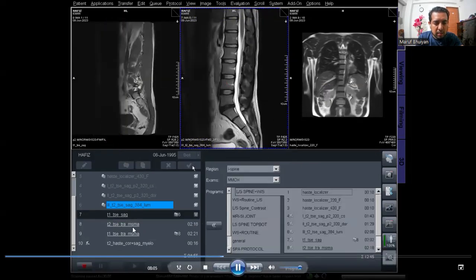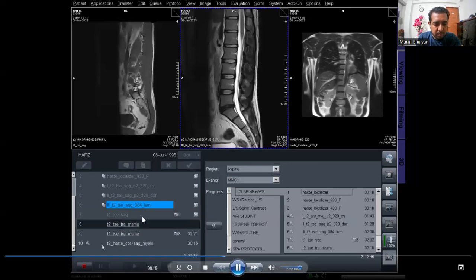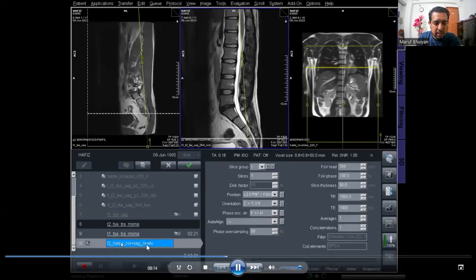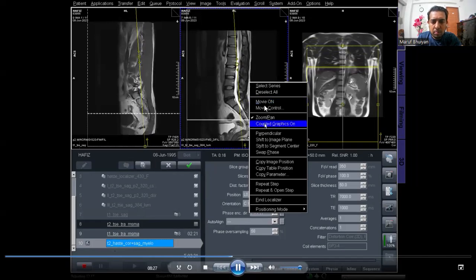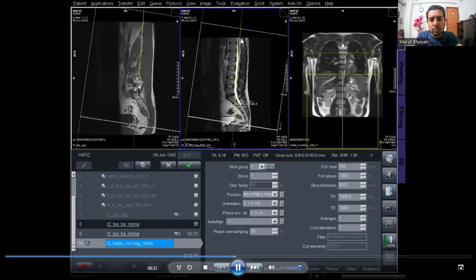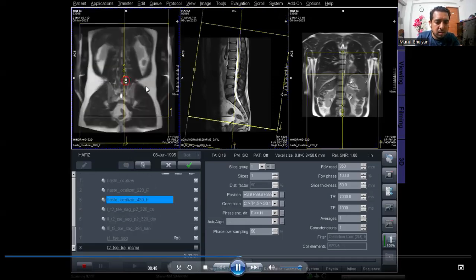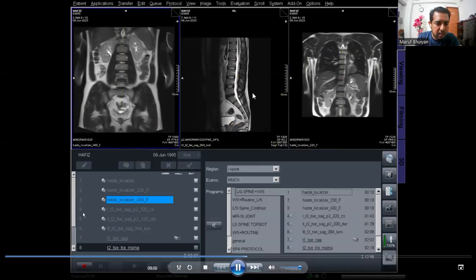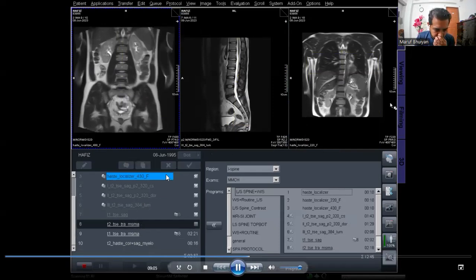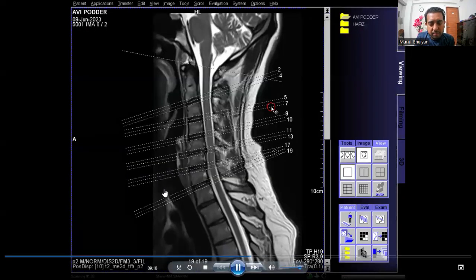Now for the coronal myelogram — T2 coronal and sagittal myelogram. The myelogram is one thick slice; the slice thickness is 50 mm. I am planning the coronal myelogram on the sagittal image so the slice will be on the spinal cord. I also check the coronal image of the lumbar spine. This is the sagittal plan and I am planning on the coronal image. All the planning has completed — now just the scanning is running.